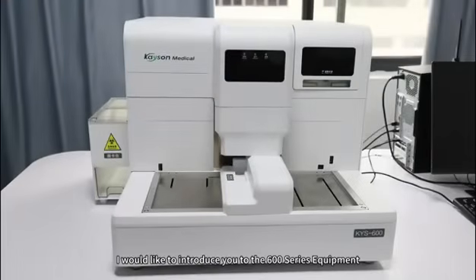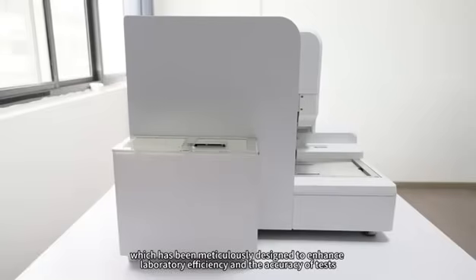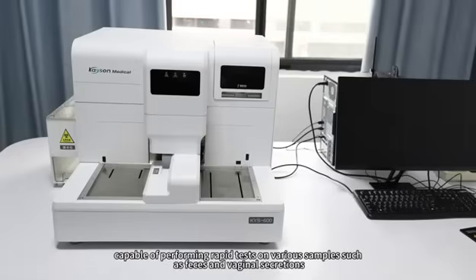Today, I would like to introduce you to the 600 series equipment, which has been meticulously designed to enhance laboratory efficiency and the accuracy of tests. This equipment is versatile, capable of performing rapid tests on various samples such as feces and vaginal secretions.